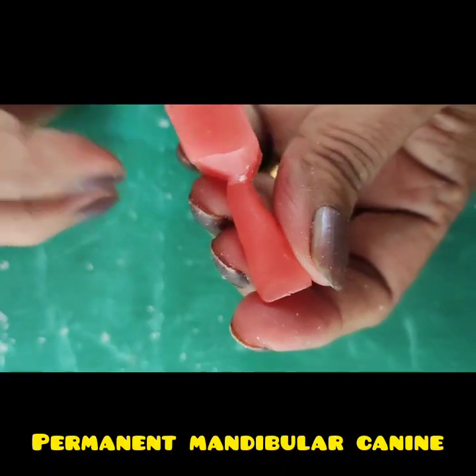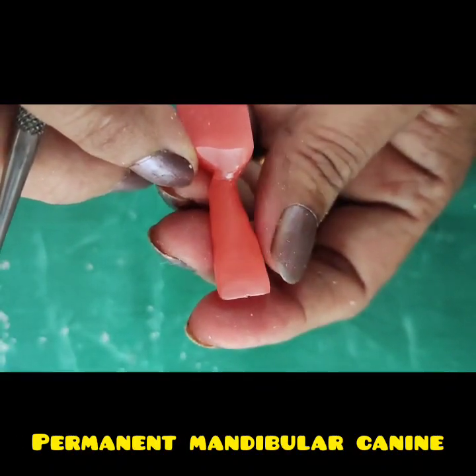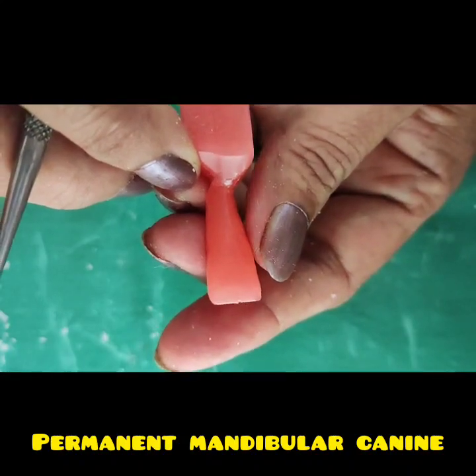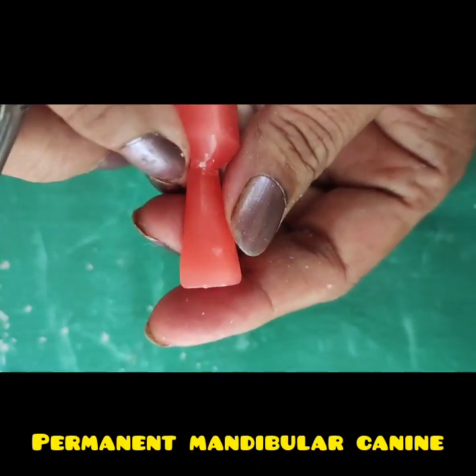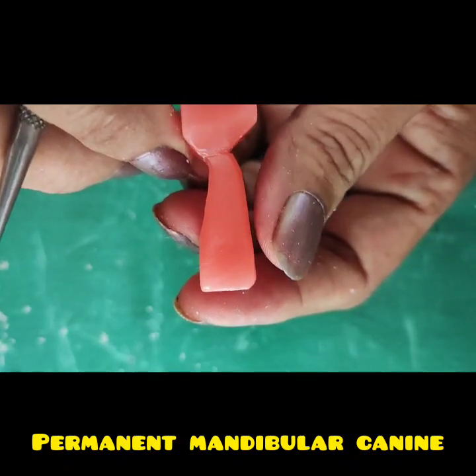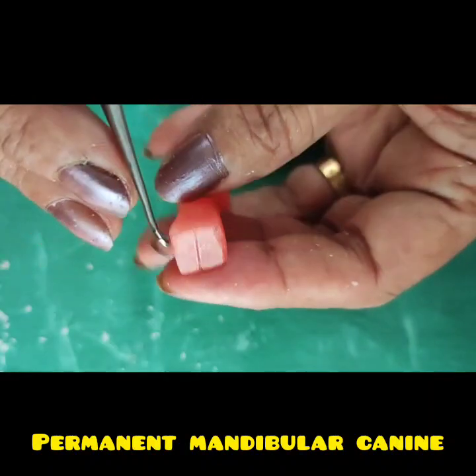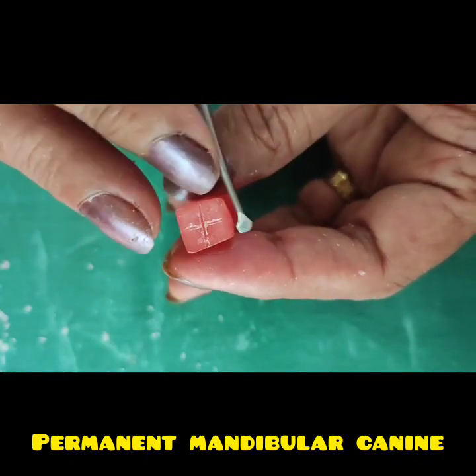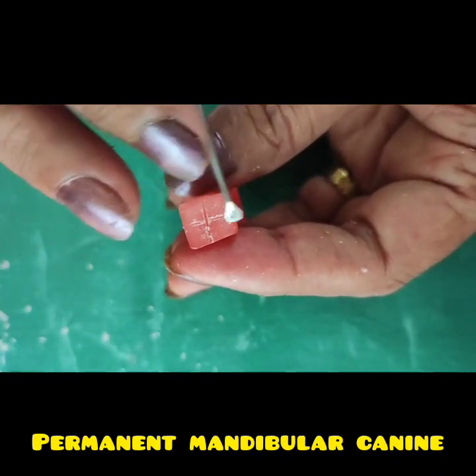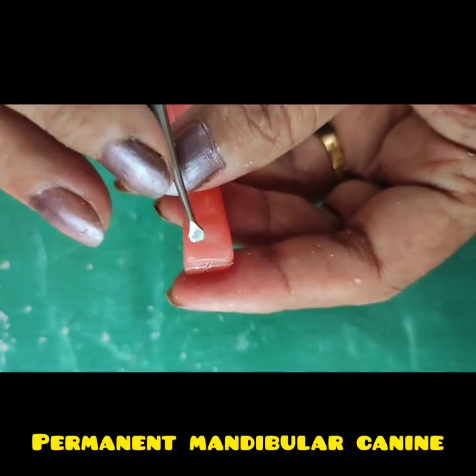Let us begin with carving of mandibular permanent canine. The steps are all the same, only minor differences are there. Here I have already carved the root with the distal tilt, and the crown I have roughly reduced according to the dimension, and this dimension is my wider dimension. So I'll keep this as the mesiodistal dimension, and this will be my labial.